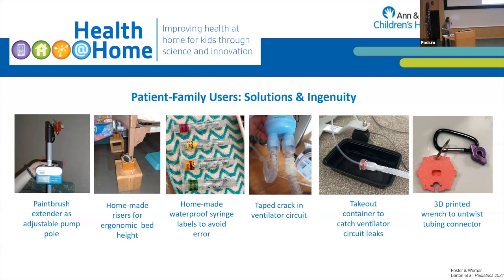So you can see on the left, we see a family trying to figure out how they're going to have their pump be adjustable in the case of their home by using basically a paintbrush pole that they got at a craft store. You can see families making homemade bed risers so that it can be at an ergonomic height for their ability to avoid their own injury. We have families making waterproof syringe labels to avoid errors because of ink wiping off of syringes, and you're seeing tapes, just basic taping of ventilator circuits, and literally takeout containers for leaking equipment that we just really don't want to be seeing for life-saving equipment in the home.